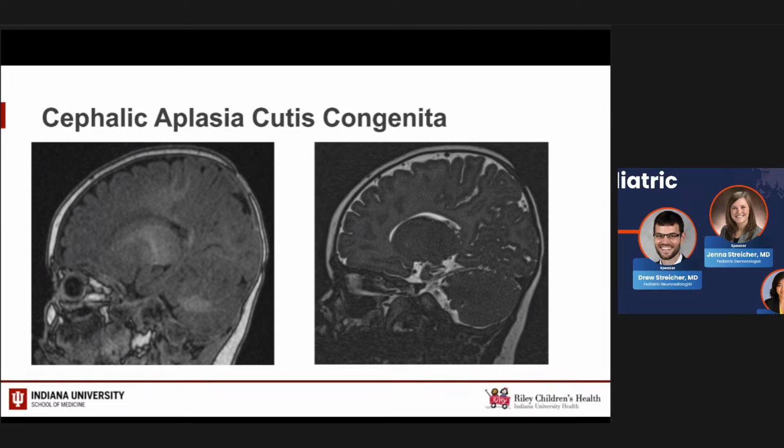I am drawn to this area in the parietal occipital lobe. I'm wondering if there are too many gyral folds there. Kind of tough to tell, we're just volume averaging through a region. But yeah, it does look a little funny in that parietal occipital region. I agree. So let's focus on the more superficial structures in this case.